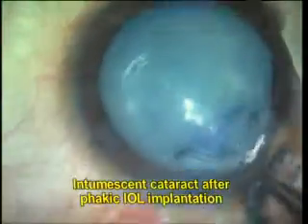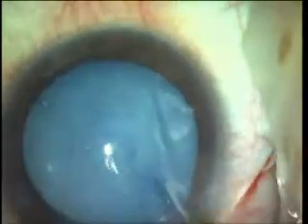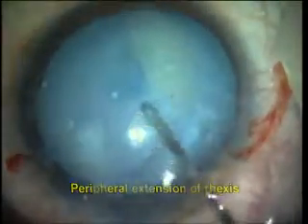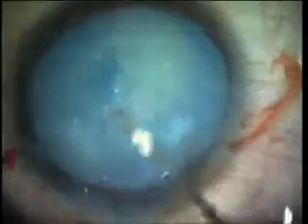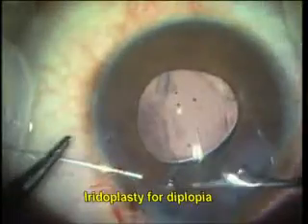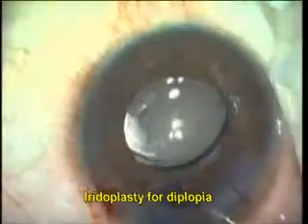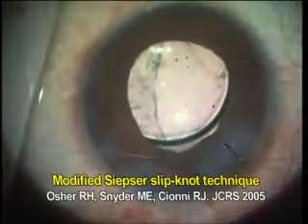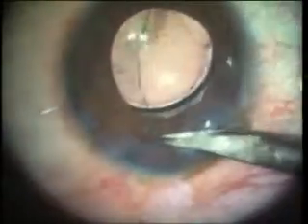Explantation of the ICL may become necessary in the setting of a cataract. A white intumescent cataract may be associated with problems in completing the rhexis successfully. However, the patients generally being young do not have a significantly dense nucleus. IOL power calculation should be performed carefully. Large iridectomy should be avoided as they can cause diplopia, especially if not covered by the lid. These may be sutured and made smaller if required.